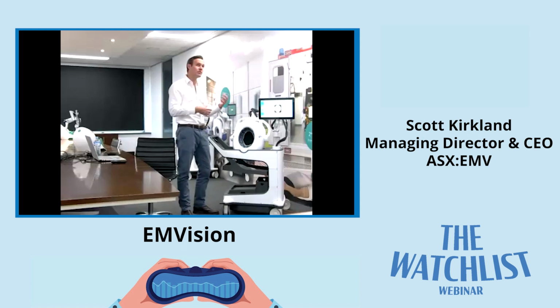or not. If there is a stroke, is it ischemic or hemorrhagic? If it is ischemic, is it potentially a large vessel occlusion? Where is it in the brain? So localizing it as well and showing a picture.